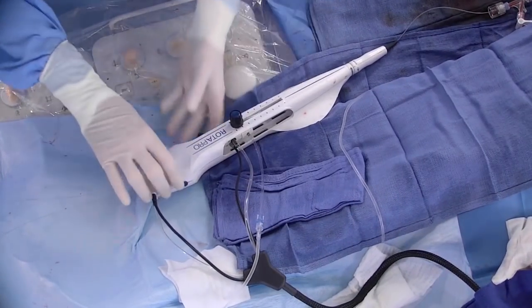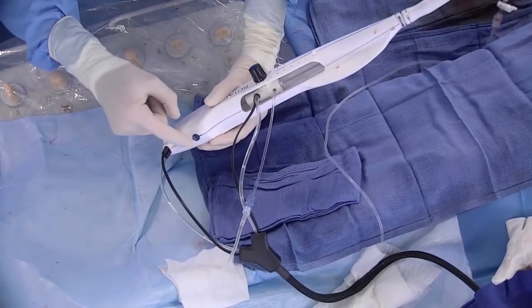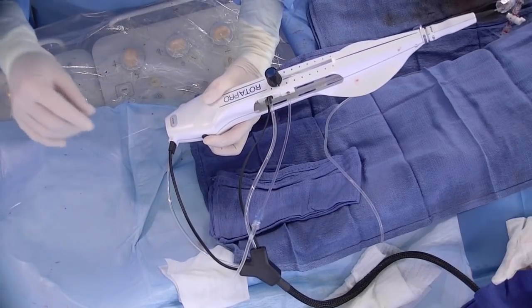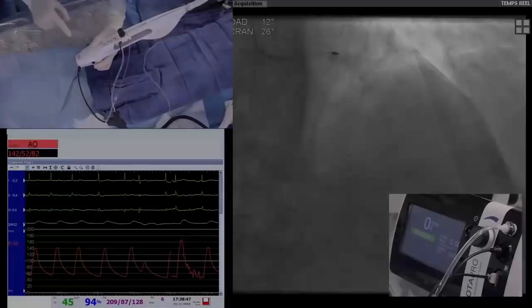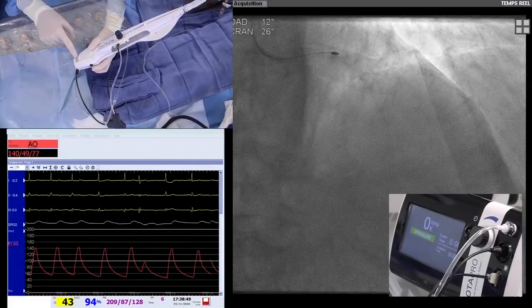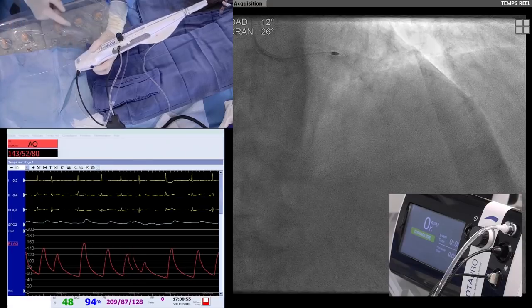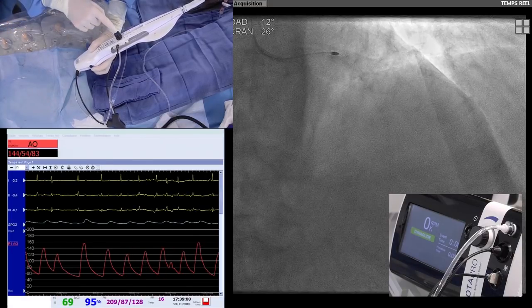Correct. To start the Dynaglide, you have to push on this button on the other side. But do we need to switch from the rotational mode to Dynaglide mode first by pushing that one, perhaps? Yes. I push on the Dyna, and you can see the green light in this part. And then I have to start by pushing this button, not the previous one.